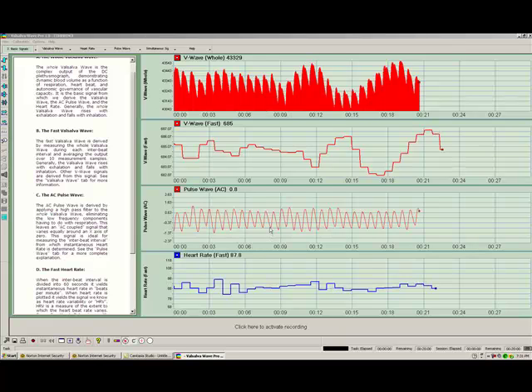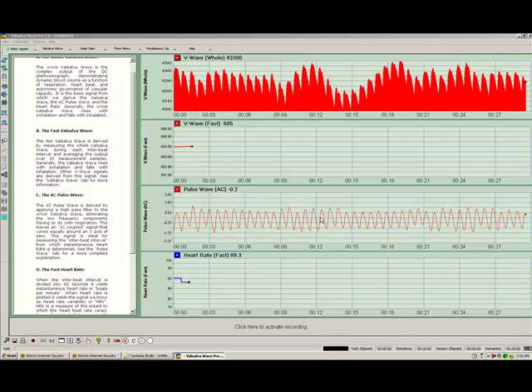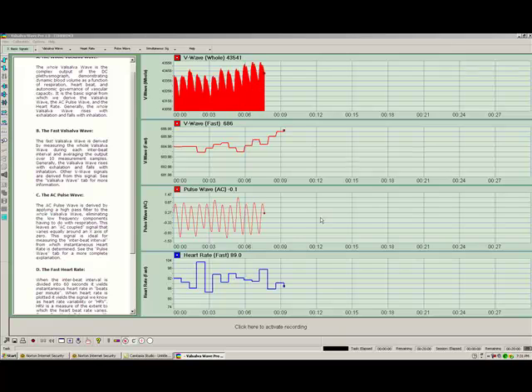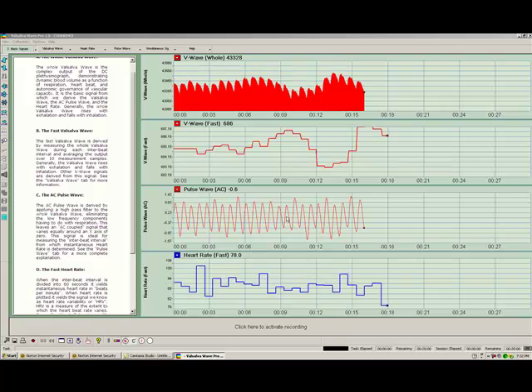If the pulse wave happens to look ragged or erratic, then it typically means that the sensor is not applied to the body snugly enough. This being said, the general goal is to apply the sensor as loosely as possible while picking up the whole valsalva wave and the AC pulse wave.